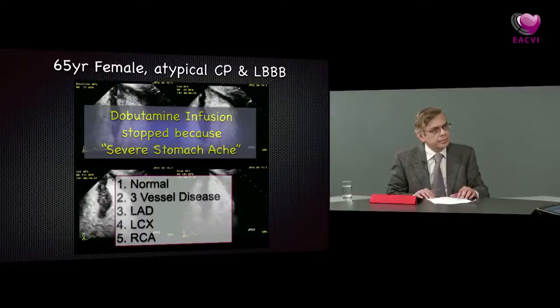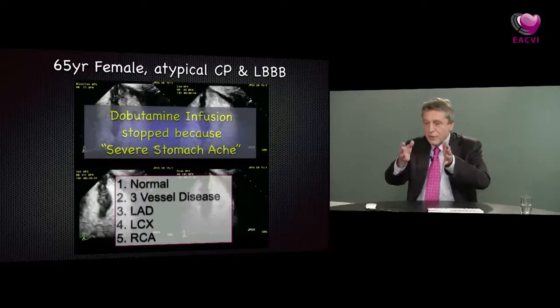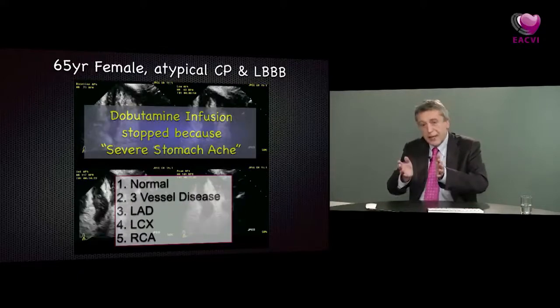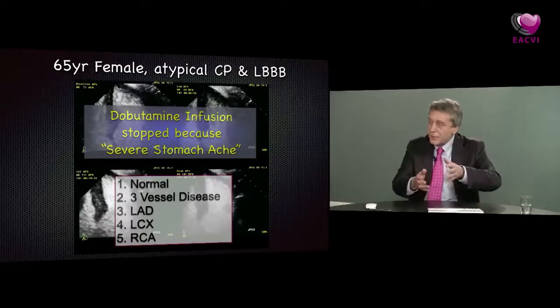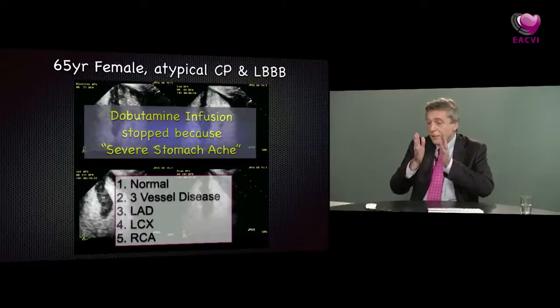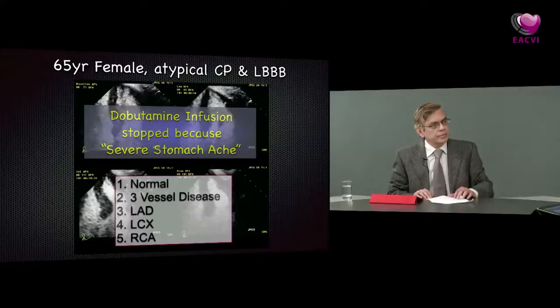And the other thing that I think is a difficult thing for people to remember, but actually works very well, is sometimes it's nice just to get the myocardial segments that you're interested in the middle of the image, where the sensitivity is higher. So if you're doing an apical 4-chamber view, start off with the septum right in the middle and then swing the transducer so the lateral wall's in the middle. Then do the same with the 2-chamber and the 3-chamber view, because the sensitivity is going to be greater in the center of the image, and there's going to be less chance that you're going to get these artifacts that you were just asking me about.